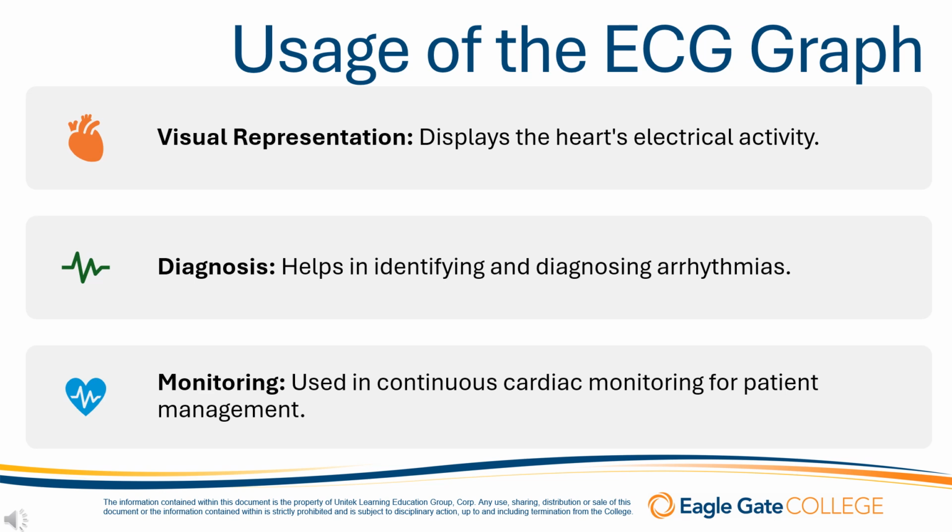The ECG is critical for diagnosing myocardial infarction. ST segment elevation or depression, T wave inversions, and the presence of pathological Q waves can indicate myocardial injury or infarction. Early detection through ECG allows for prompt treatment, which is vital for patient outcomes.